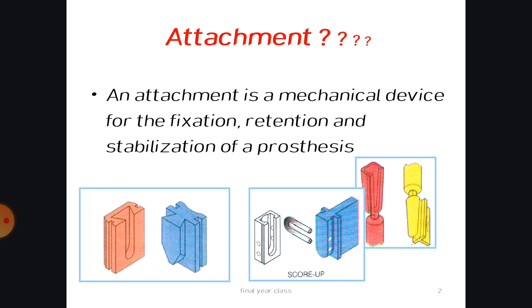An attachment is a mechanical device for the fixation, retention, and stabilization of a prosthesis. This is the definition given in the Glossary of Prosthodontic Terms for attachment. So in some cases, we use attachments for better retention of the denture rather than going in the conventional way.